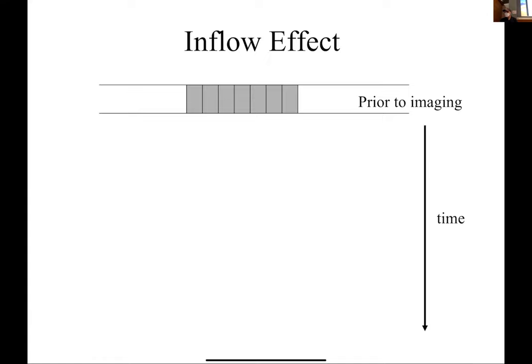And we're going to go into one last way of looking at blood flow, which is what's called the inflow effect. I want to state a really important point: I'm not sure what the percentage is, but a lot of things that are used clinically now started off as artifacts. People acquire an image and say, oh my God, the vessels look really bright on this image, this is terrible, we need to figure out how to get rid of this. But then someone else comes along and says, actually that's really useful because I really want to see the vessels, okay? So it turns out a lot of the mistakes actually turn out to be the solutions.